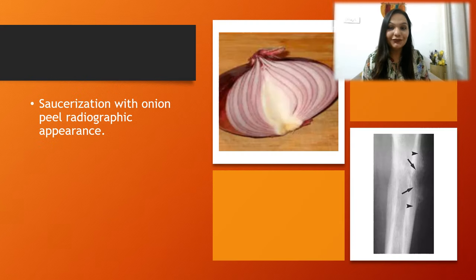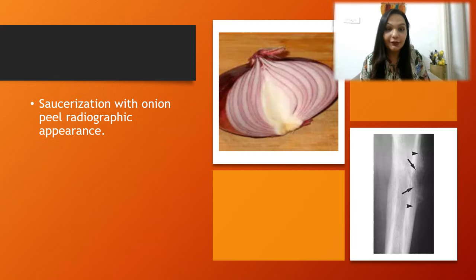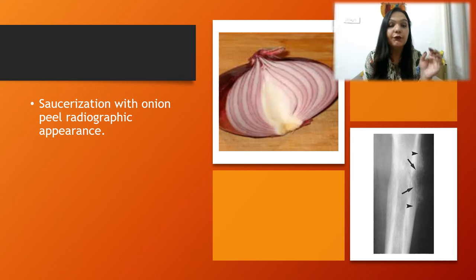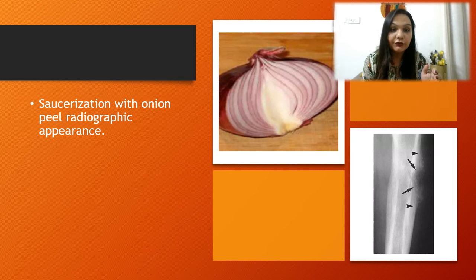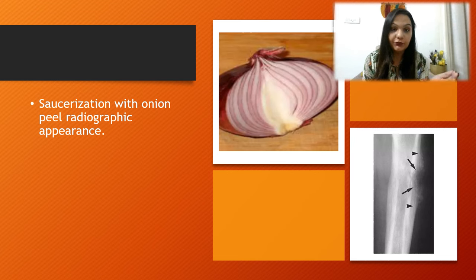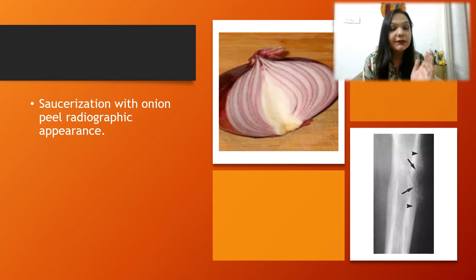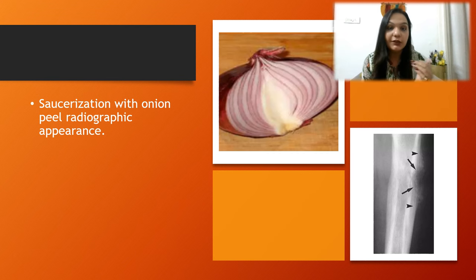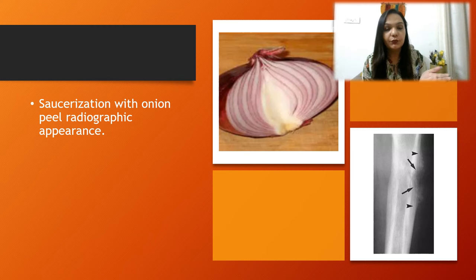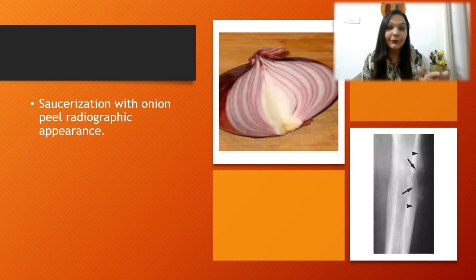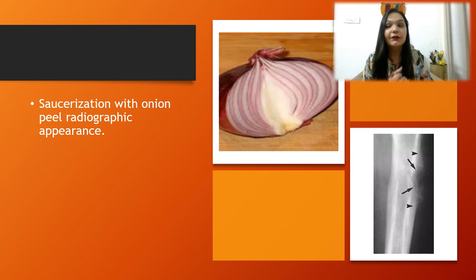This image of an onion cut in half shows the laminated appearance, which is exactly what we see on radiographic imaging. Focusing on the periosteal reaction, we notice laminated lines — that is the onion peel or onion skin reaction. Saucerization refers to the indentation or saucer-like appearance of the bone. These two features are the key findings to remember.